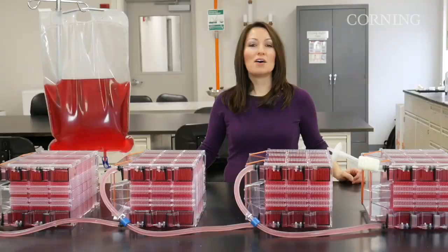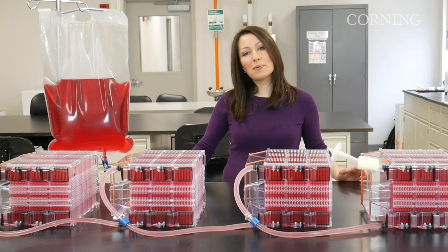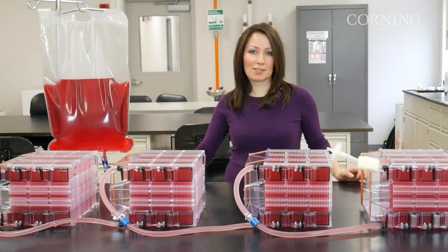For those who need significant cell yields, a manifolded setup is best. You can typically grow two billion cells in a single 36-layer HyperStack, but by manifolding several vessels together, you can generate 200 billion cells or more in a single batch.